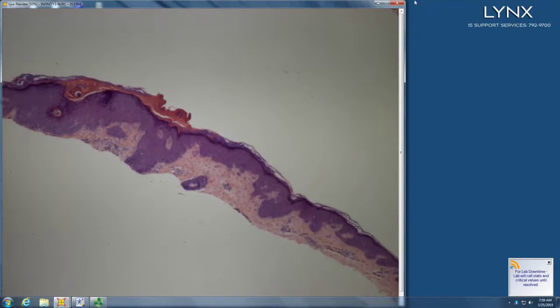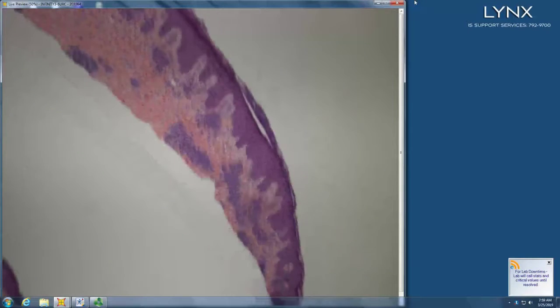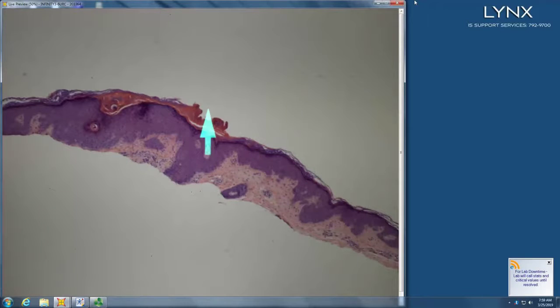I want to see another slide. It seems there's some information there. But actually, you don't want to see another slide. You want to see that one right there. Oh, scabies. Yes.